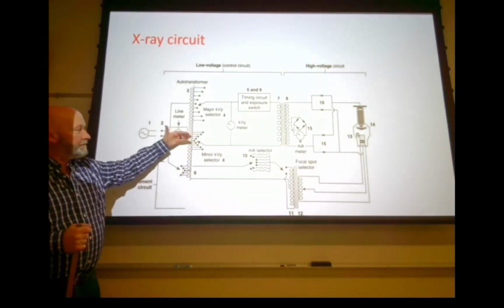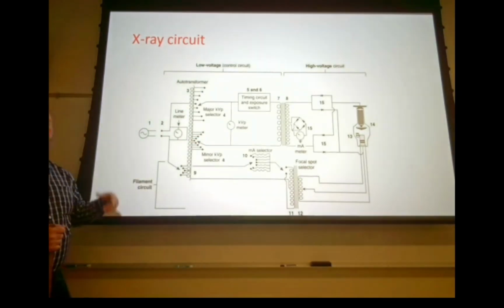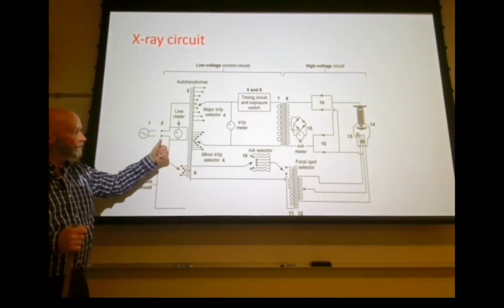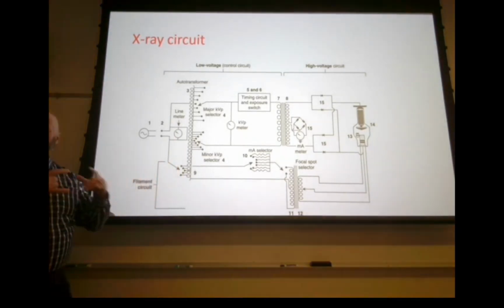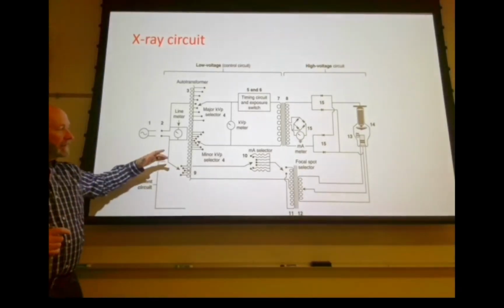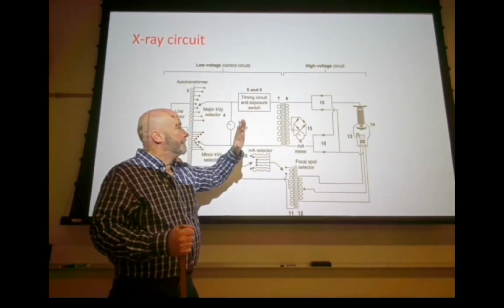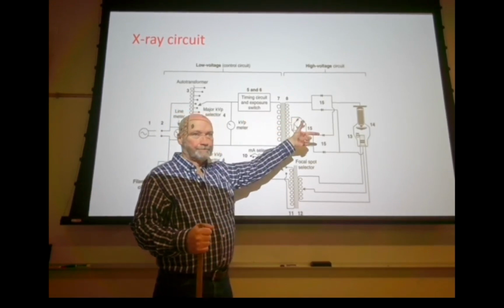So what you're actually doing is you're making contacts on the secondary side of the auto transformer. It works off transformer law, and transformer law says that if you feed alternating current to the primary side of any kind of transformer, then you create a changing magnetic field. The magnetic field flips back and forth, and if we move a secondary coil close to it, then we can create an alternating current in the secondary coil.